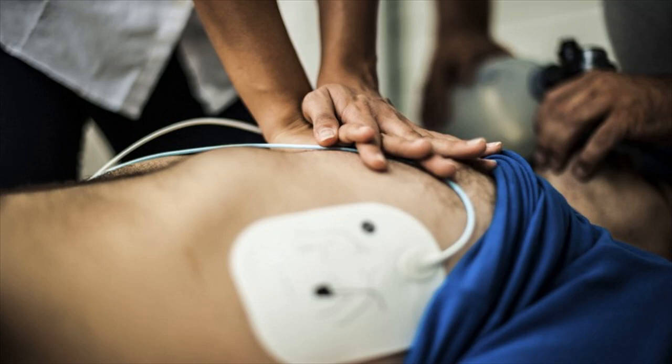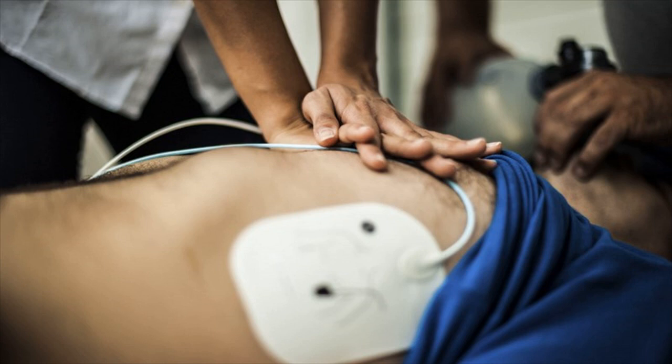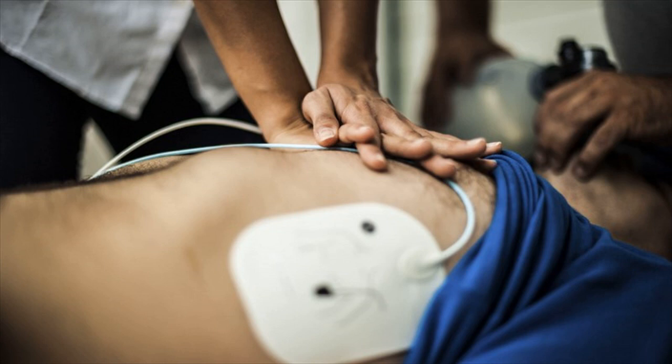The key difference between monophasic and biphasic defibrillators is that the monophasic defibrillator is a type of defibrillation waveform where a shock is delivered to the heart from one vector, as shown below. Whereas, in biphasic defibrillation, shock is delivered to the heart via two vectors. In other words, monophasic shock is given in only one direction, from one electrode to the other.